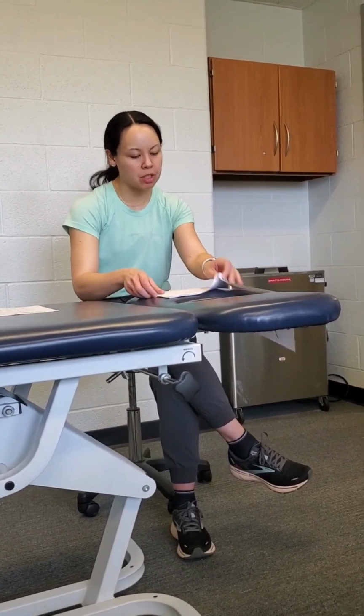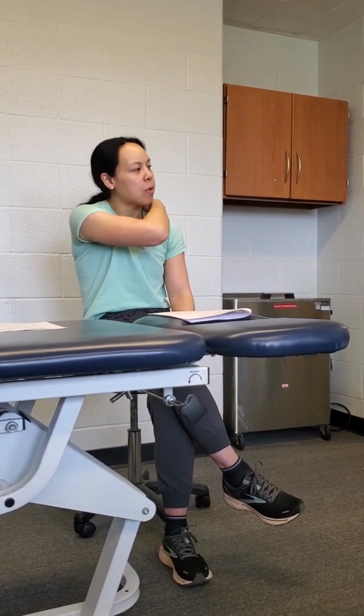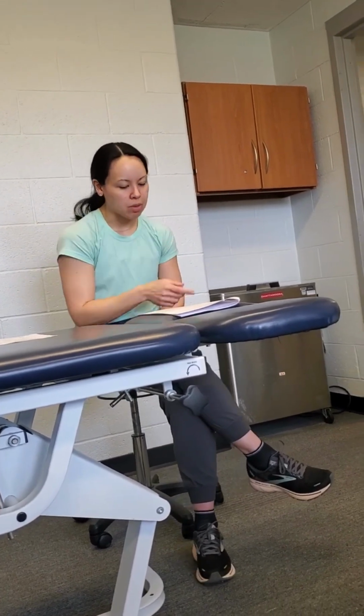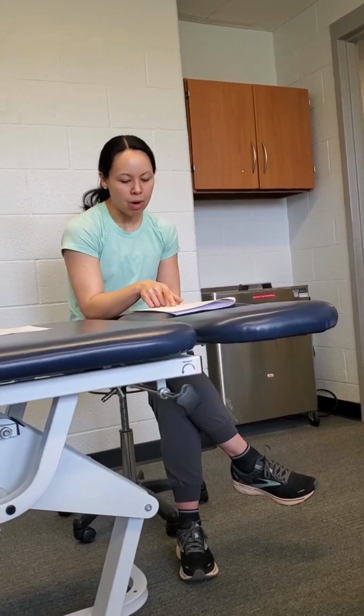Oh, this is probably good to talk about, the proximal effects. For example, if you're working with someone, let's take the shoulder, recovering from rotator cuff surgery. They've got a lot of atrophy back here, but we're putting the cuff distal to that. Studies have shown there's a proximal effect. Even though the cuff is below the targeted muscle group, they're still going to gain strength, which I thought was interesting too. So there's the downstream fatigue, backflow proximal effect.